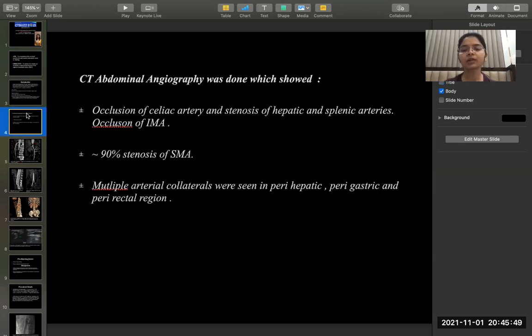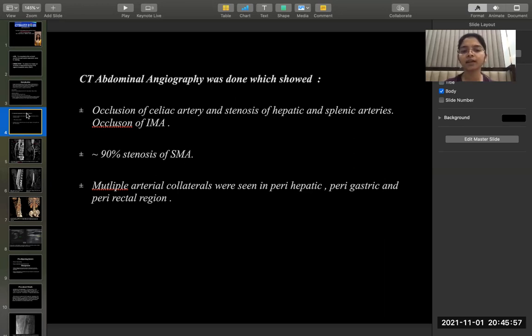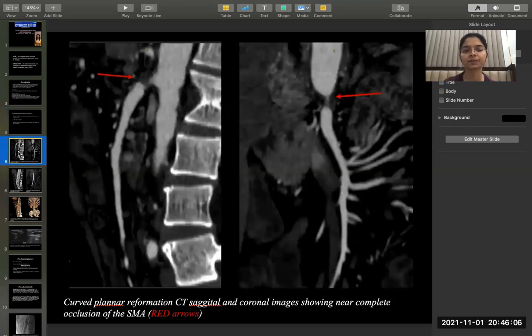CT abdominal angiography showed presence of occlusion of the celiac artery and stenosis of the hepatic and splenic arteries, along with occlusion of the IMA. 90% stenosis of the SMA was seen. Multiple arterial collaterals were seen in the perihepatic, perigastric, and perirectal regions.